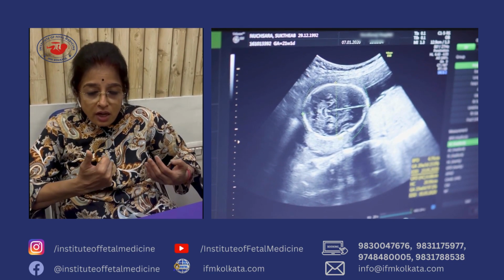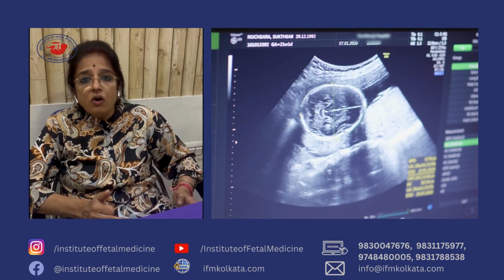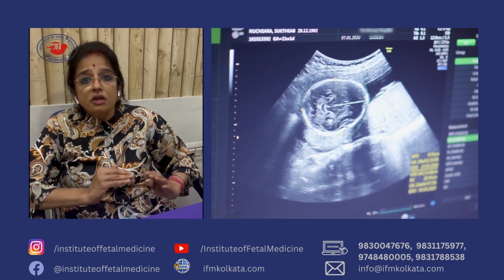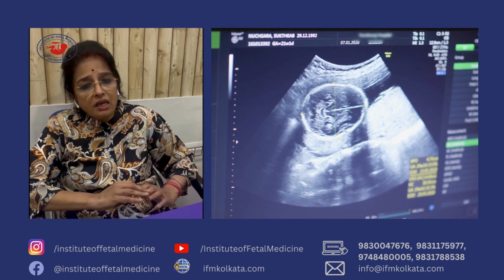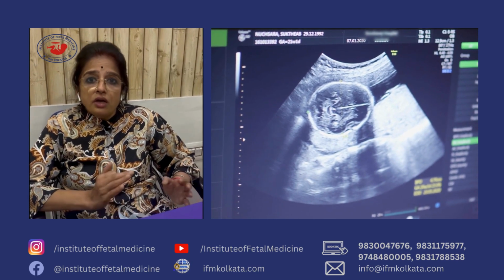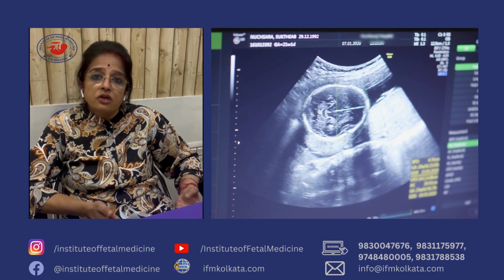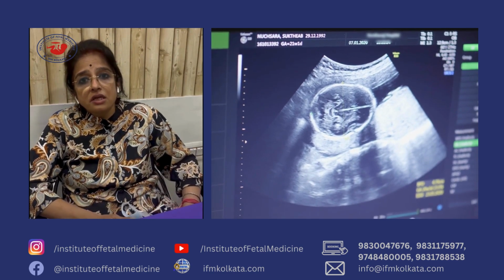So I would request you to overcome all the negative feelings towards TVS and take advantage of this procedure to reach a beautiful imaging and also a conclusive and more precise diagnosis in any gynecological conditions, like excessive bleeding or delayed periods or any kind of cystic ovaries, or where there are uterine tumors, or insertion of an intrauterine contraceptive device where we want to locate it, postmenopausal bleeding, and there are numerous indications for this.